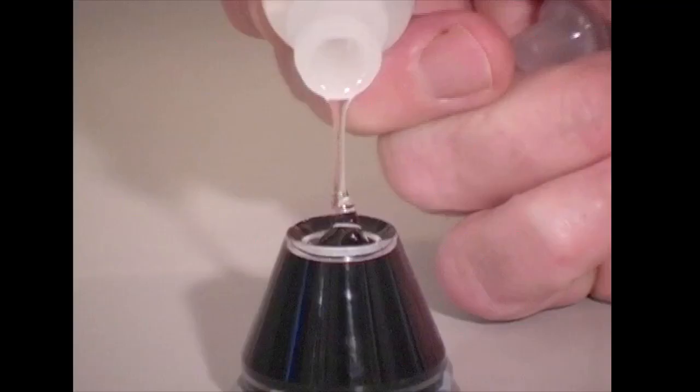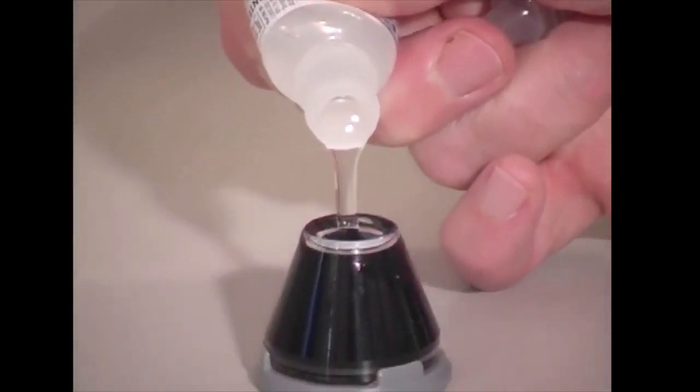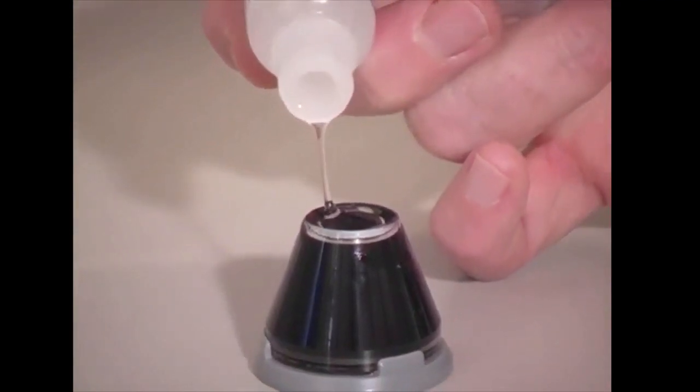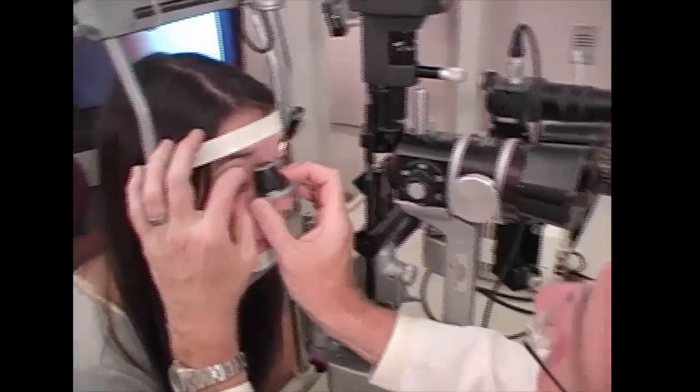Goldmann style lens, one needs to use a coupling solution, usually methyl cellulose. So it's important that that's done without bubbles. I can either start the methyl cellulose stream on a tissue and transfer it over, or I can break the tip out and just dump the methyl cellulose into the concavity of this lens. Both of those work pretty well.